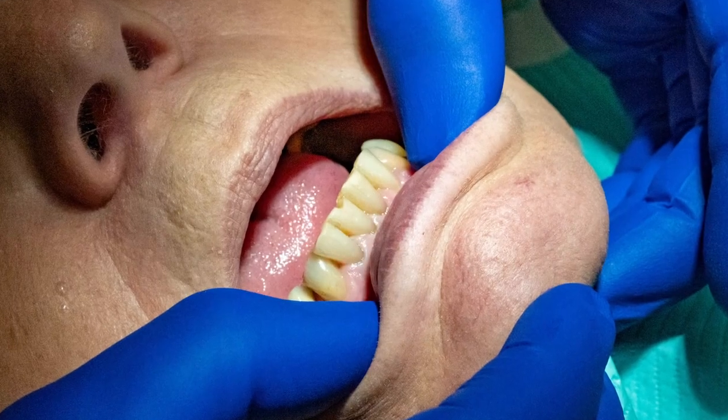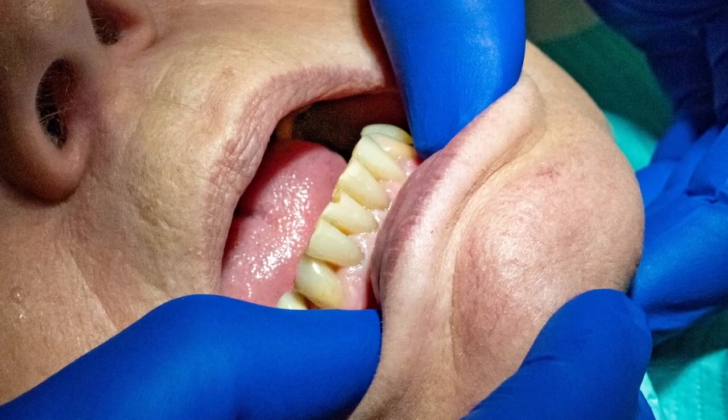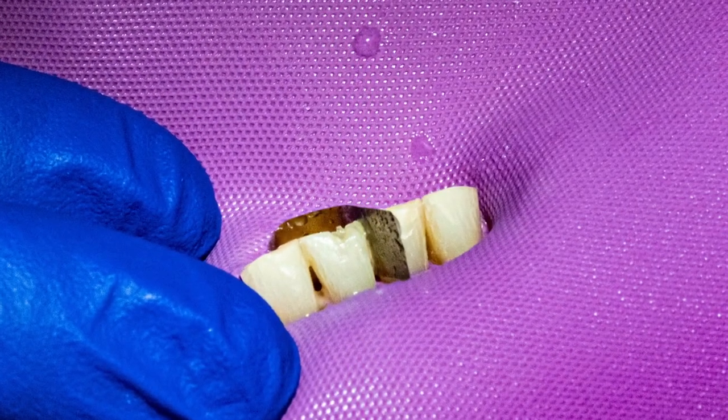We're going to fix a problem that we deal with in dentistry, which is the chip of an anterior tooth. I've developed a product that is designed to anchor the filling into position.